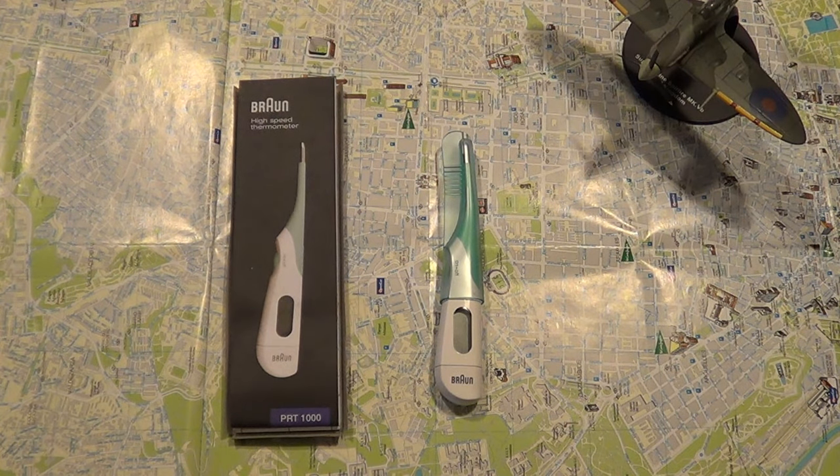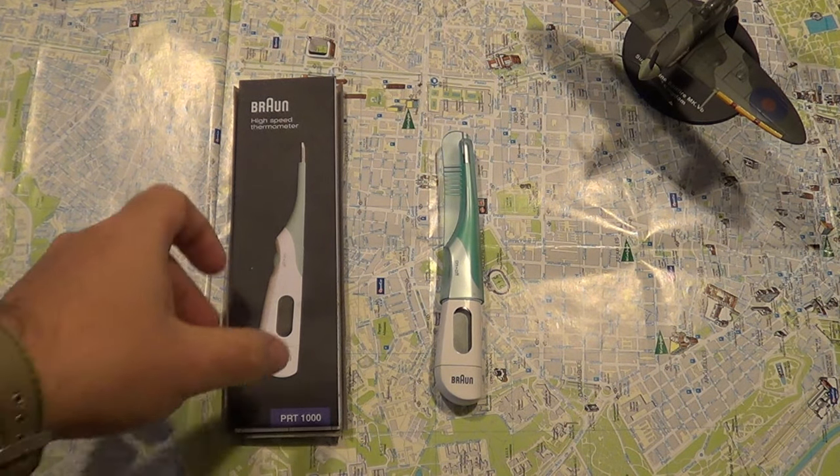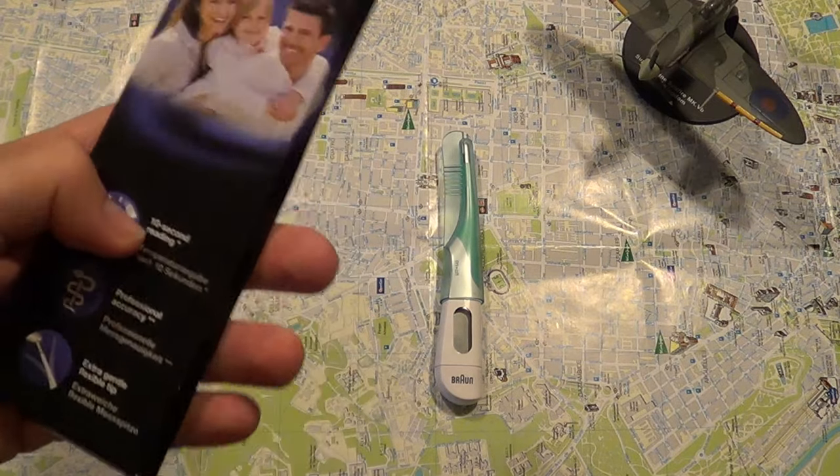Hello YouTube. Today I have a Braun high-speed thermometer, the PRT-1000. It came in a simple package.